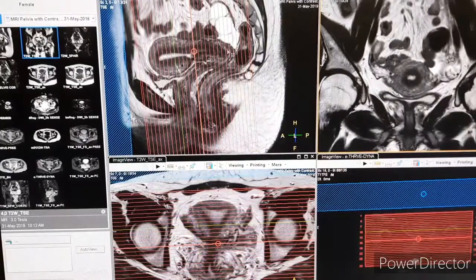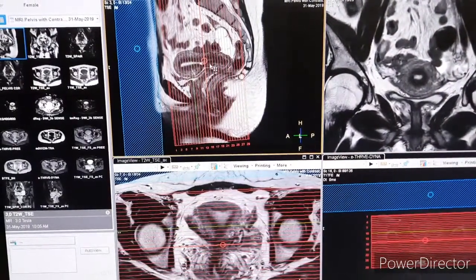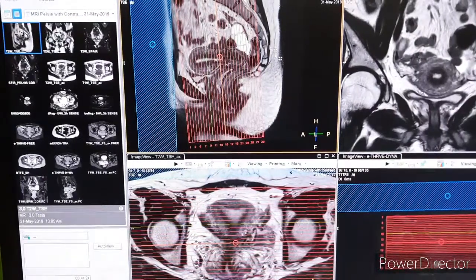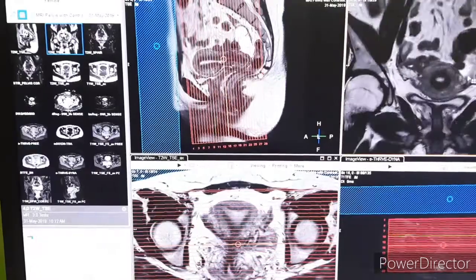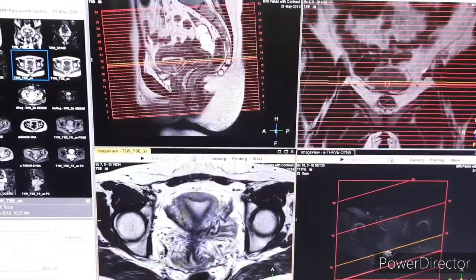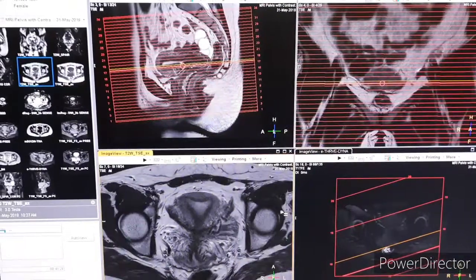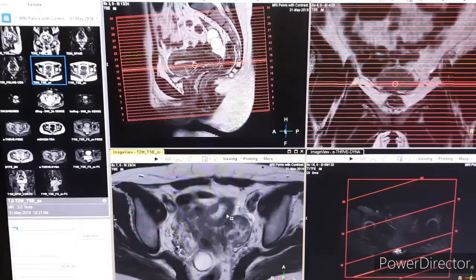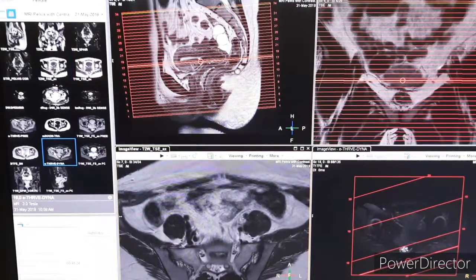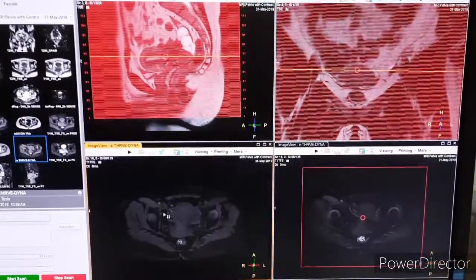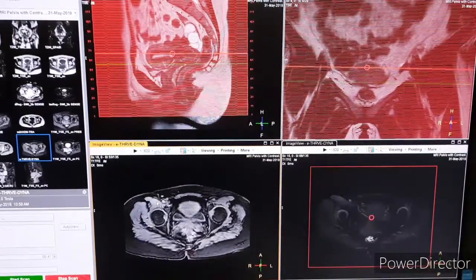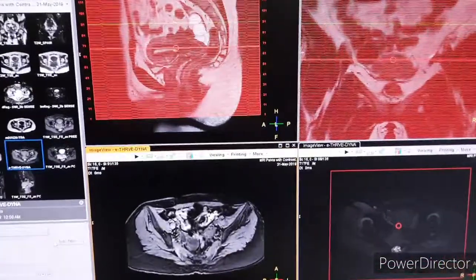After taking the sagittal, you have to take coronal. As mentioned earlier, you have to take a reference line along the endometrium — here you can see we have kept it perpendicular to the endometrium. Scrolling down, you can see the planning. For the axial, the planning is parallel to the endometrium.